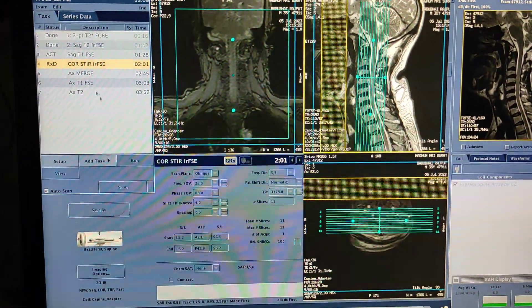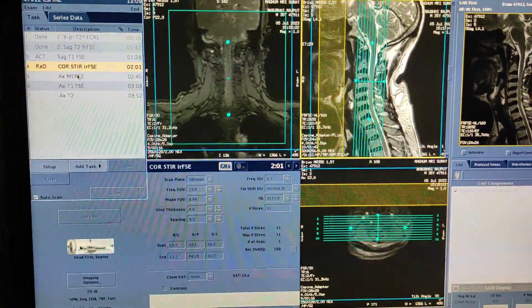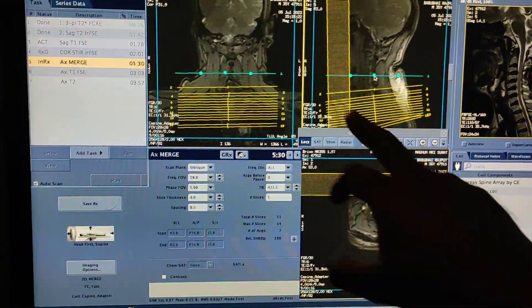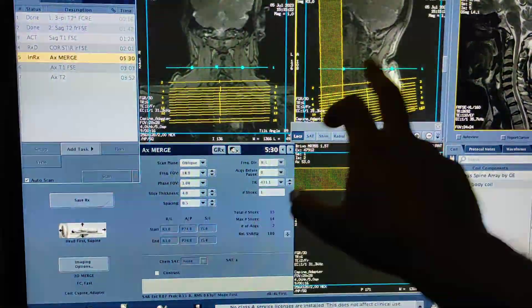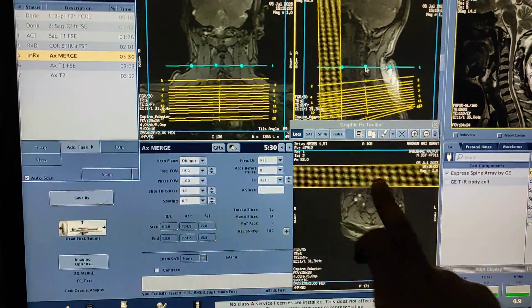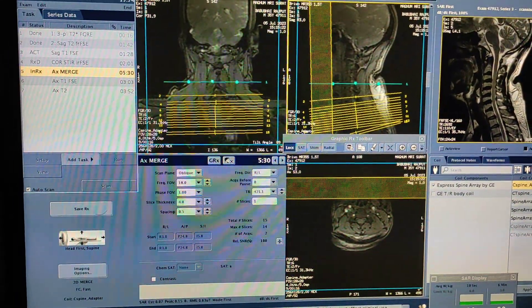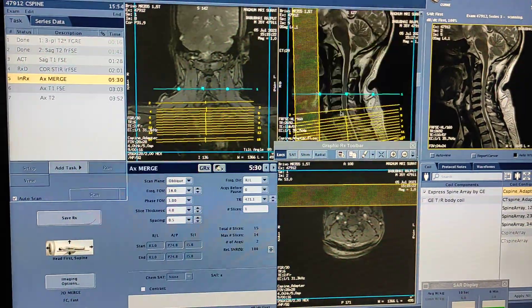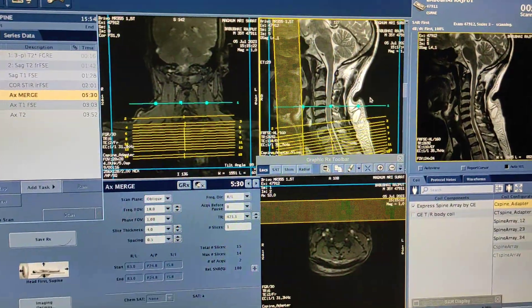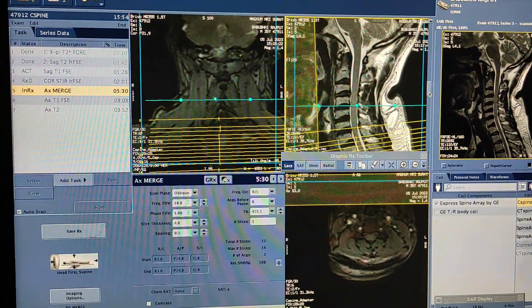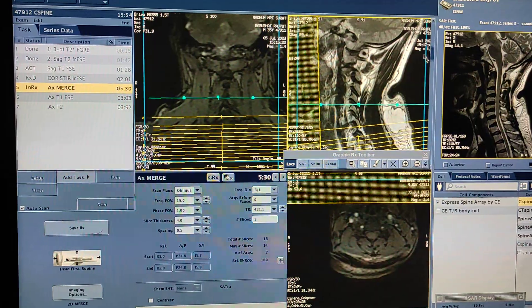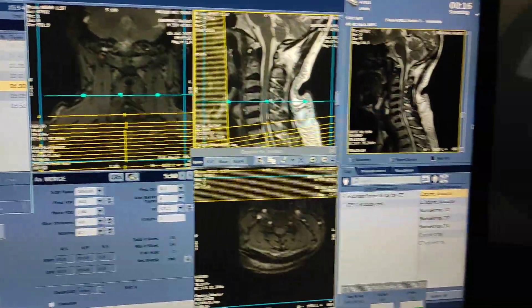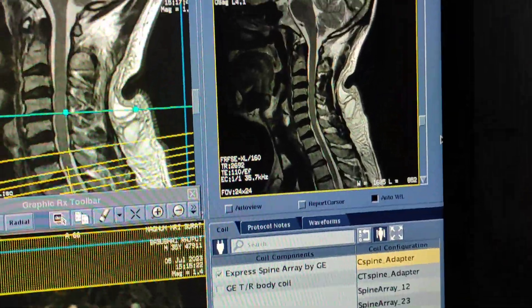Now I will plan the axial images. Click on the MERGE sequence. For axials, you have to plan on sagittal and coronals. Enter, then click on this box and enter the sagittal. For axials, first of all you have to view the right-to-left images — you will see these in this box first.